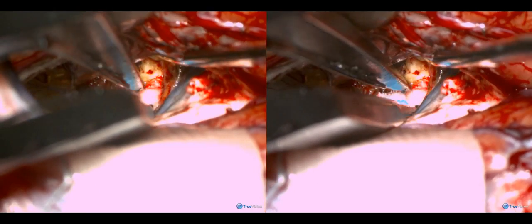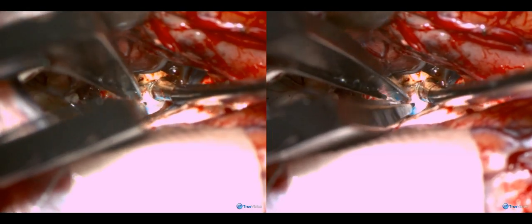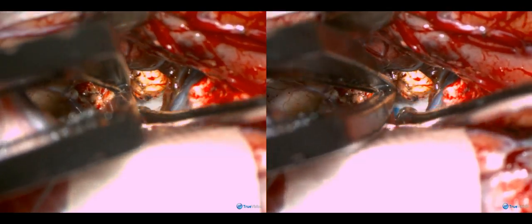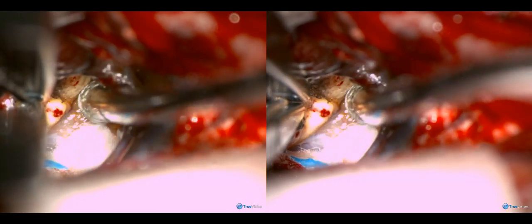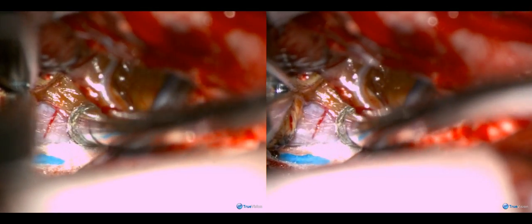With that protective layer in place, the malformation can be continued to be dissected. The gliotic plane is developed and the malformation is mobilized upward away from the gliotic plane.